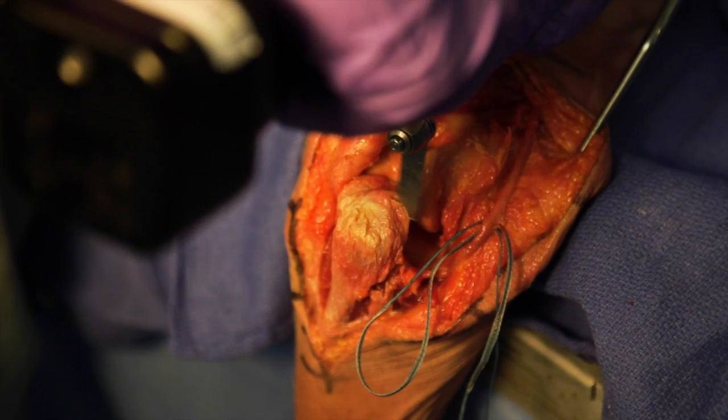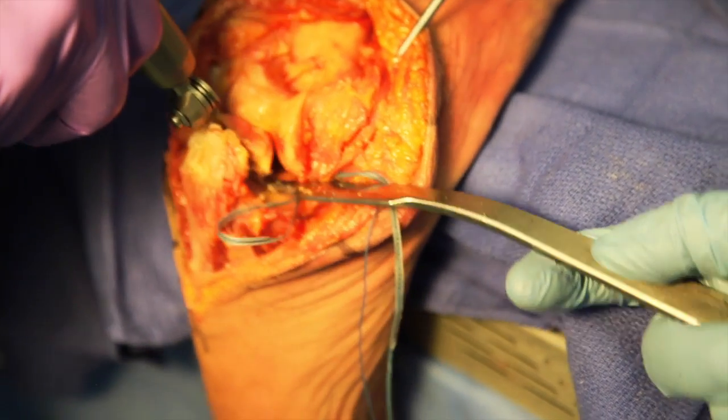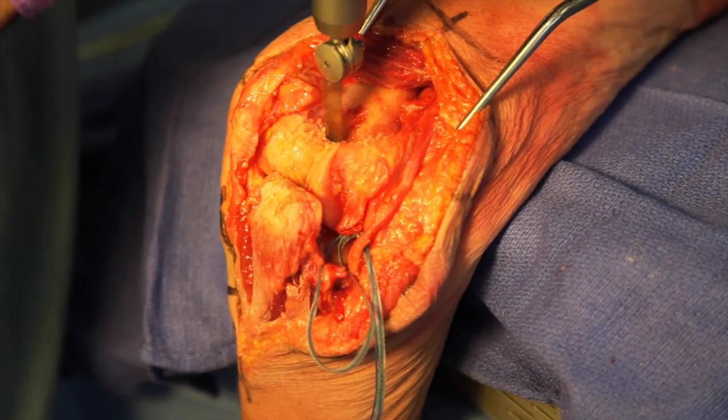Excision of the distal tip of the olecranon is then performed to better visualize the trochlea. An oscillating saw is used to remove the central portion of the trochlea.